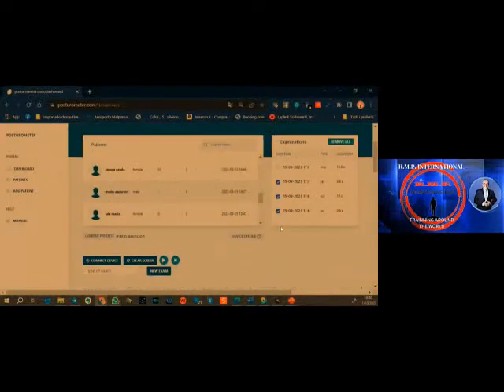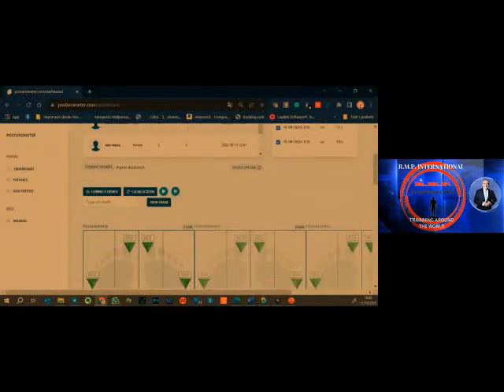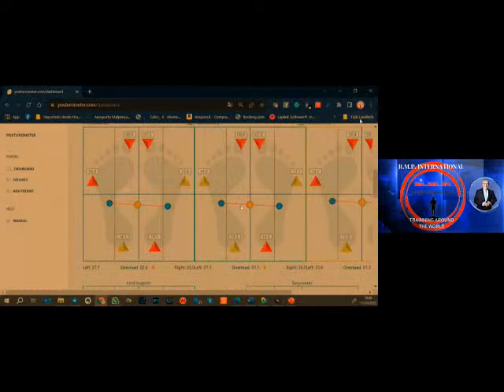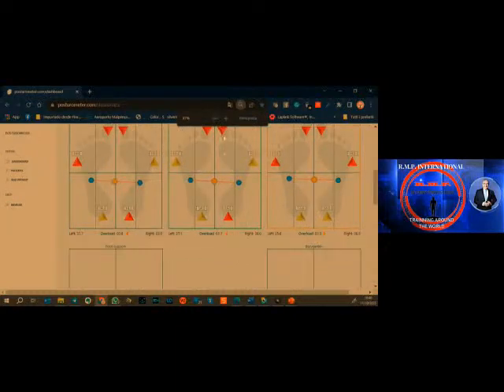And look at here. If we select 3 exams, and we click here, then we have the 3. And let me make the screen a little bit smaller, because my screen is big.